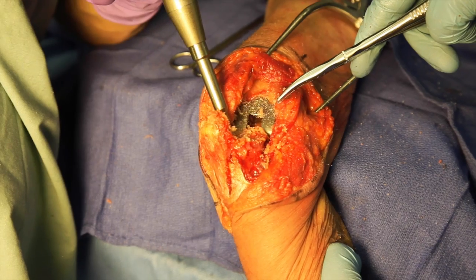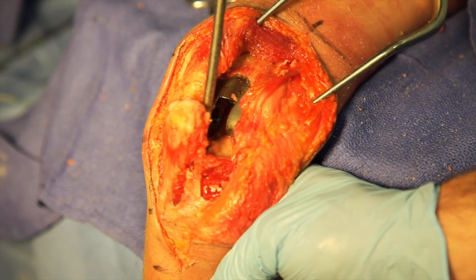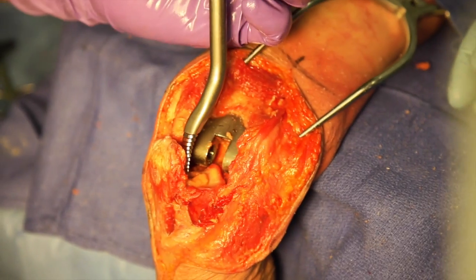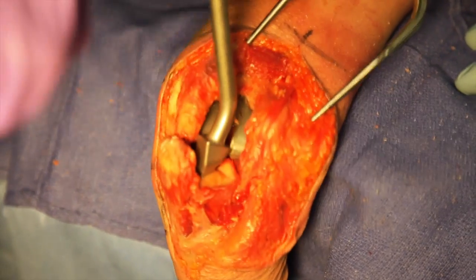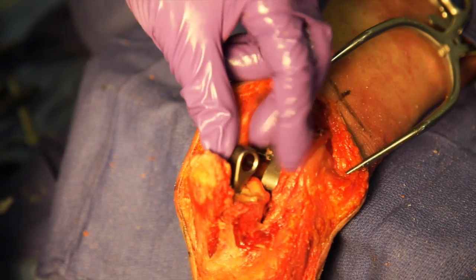Next we begin ulnar preparation. The intramedullary canal is opened with the use of a high-speed burr. A flexible reamer is used to further open the canal. Then sequential ulnar rasps are used to the correct size. The ulnar trial component is then inserted.